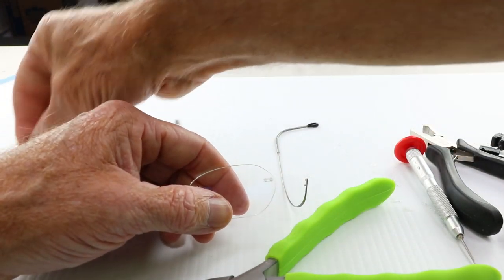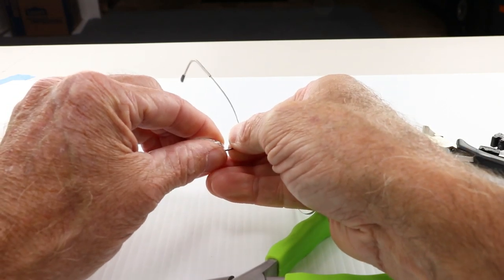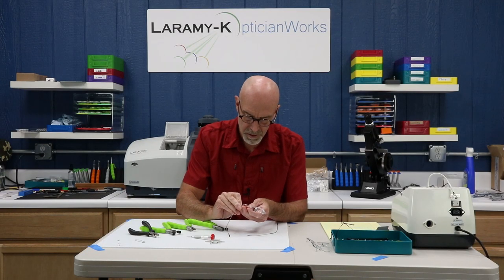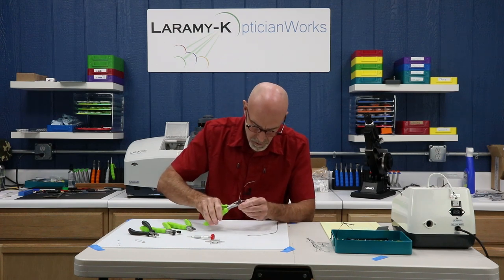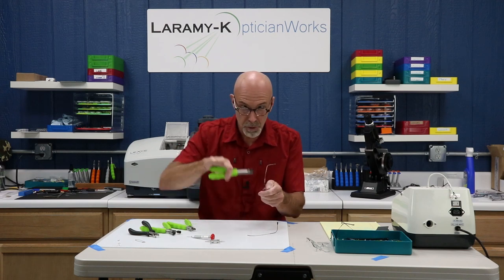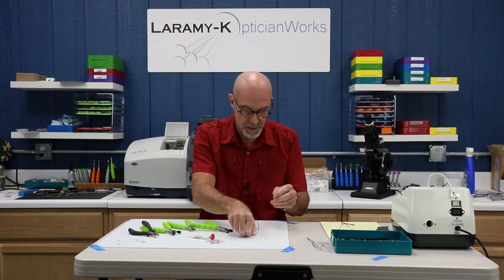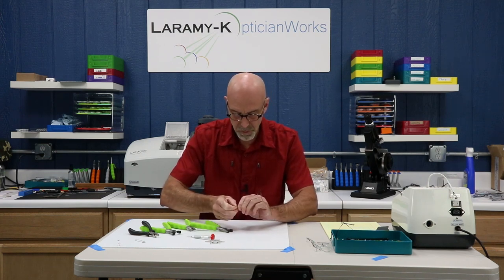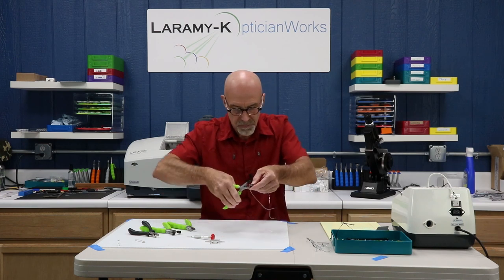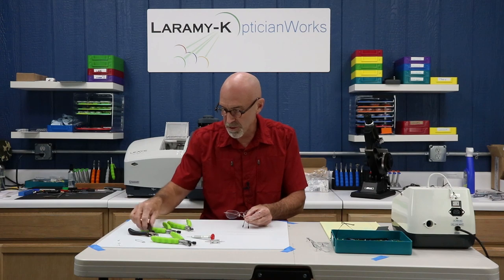Almost there. The tricky part again — make sure I've got my left temple on the left. That looks good. Easy mistake to make, so don't feel bad if you do it once or twice. Got that one started, and it feels really good. With my thumb back here pushing the bushing forward so that it fully seats, I don't want that bushing to push back out and collapse on itself. And I've got my three-piece drill mount fully rimless frame back together.